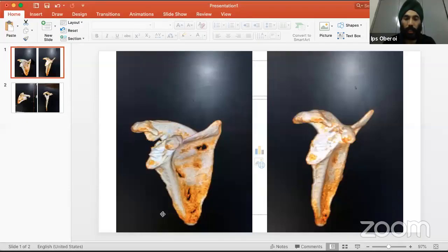The other is that it theoretically decreases the range of motion, and even though there are biomechanical studies, there are no real biologic studies that indicate that people have worse motion if you medialize. Somebody will actually send us a CT scan. So Sandeep, you can just show 3-4 films to Professor McFarland and see. Yes, Sandeep, you can share.